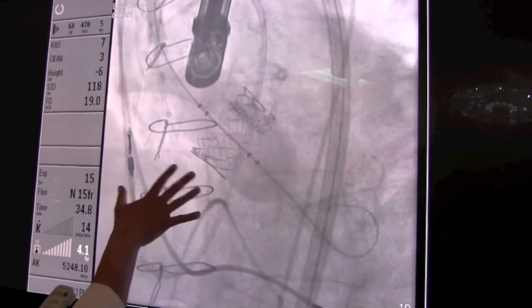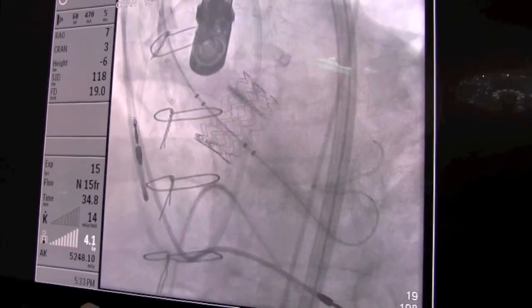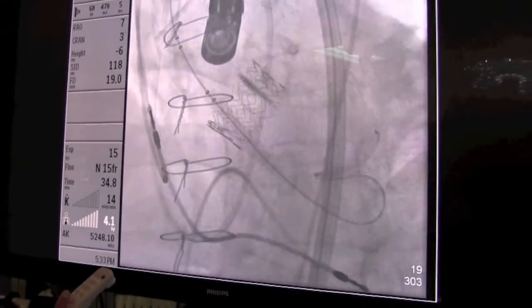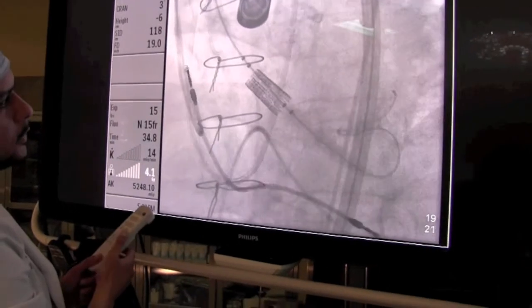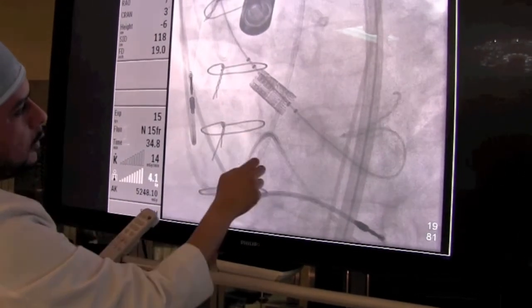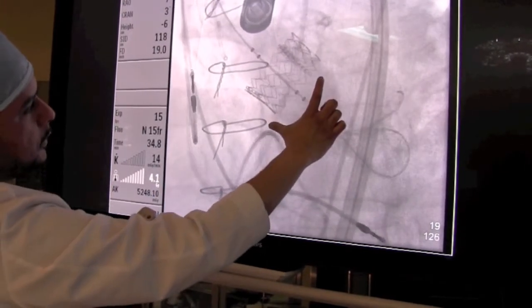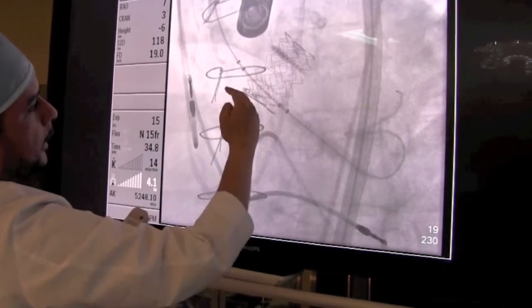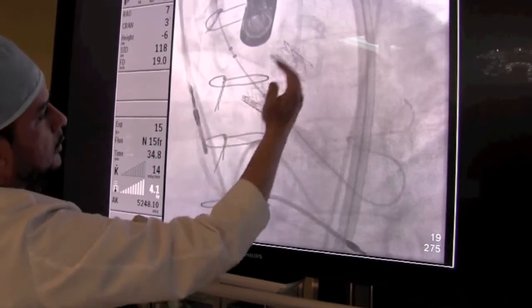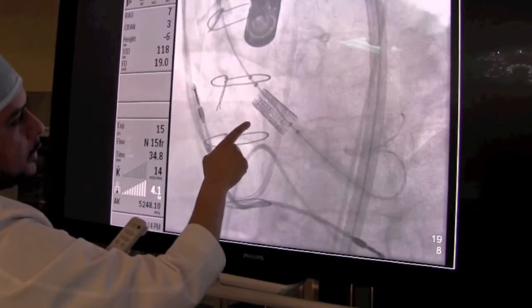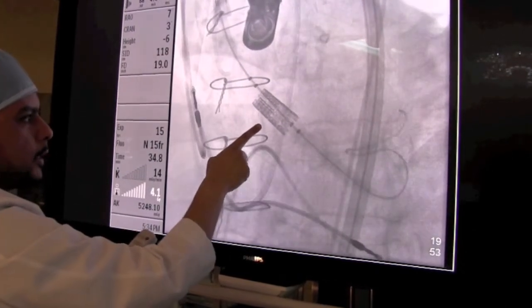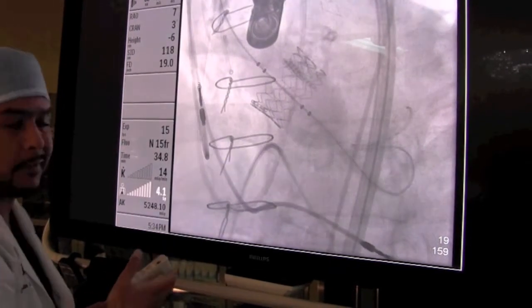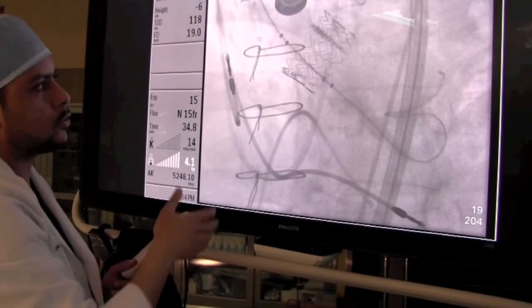This is really the final result — everything we did today revolves around getting this valve into just the right position and inflating it perfectly so that it replaces the diseased valve. We start pacing, inflate the balloon, it opens up those stent struts, and the valve takes its final form. The old diseased valve has been pushed off to the side, captured against the wall of the aorta between it and the metal stent struts. The three leaflets inside the valve begin to open and close, and as you saw at the end of the case, the leaflets were working perfectly as confirmed by echocardiography.